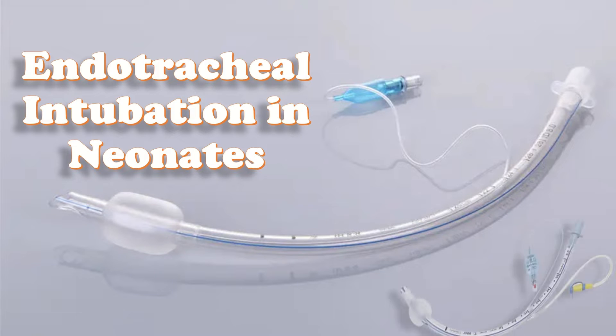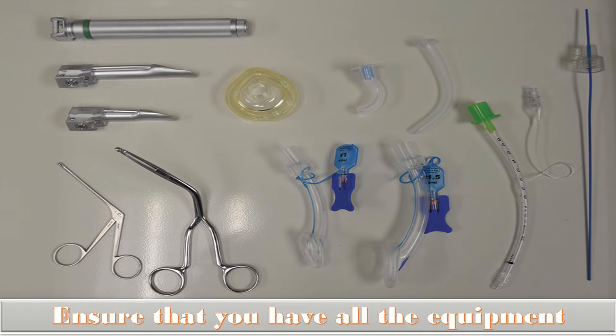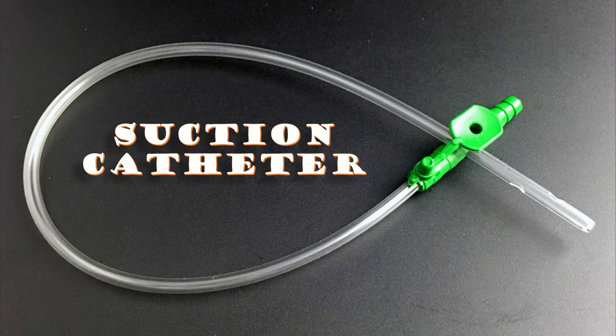First of all, ensure that you have all the equipment ready for intubation. For an endotracheal tube insertion you need several items. You have to make sure that you have an ambu bag or another device to deliver oxygen and airflow in case of not being able to intubate. You should also have a suction catheter in case there are lots of secretions, either before or after giving surfactant through an ETT.